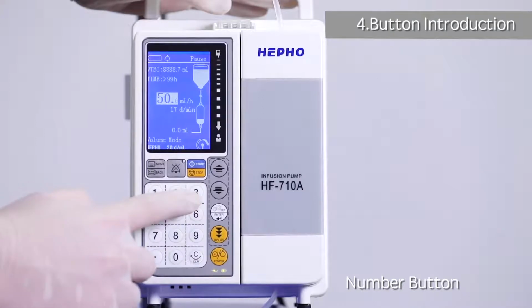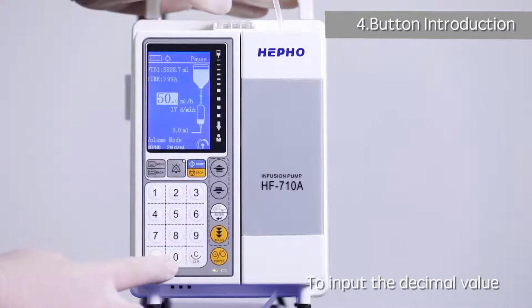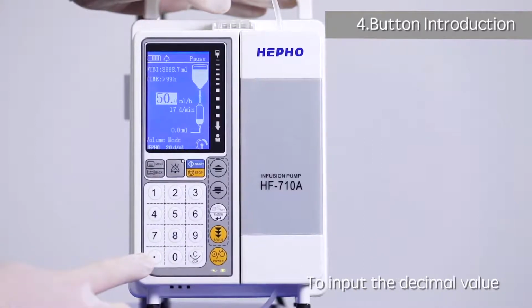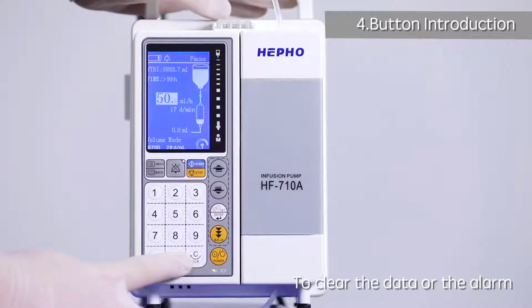Number button. To input the number. Decimal point button. To input the decimal value. Clear button. To clear the data or the alarm.